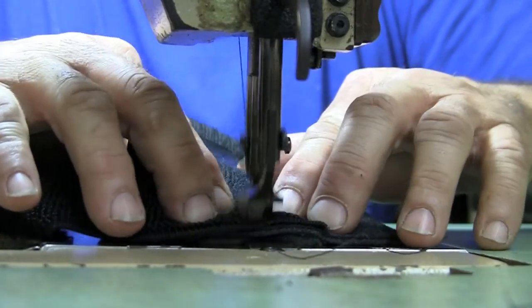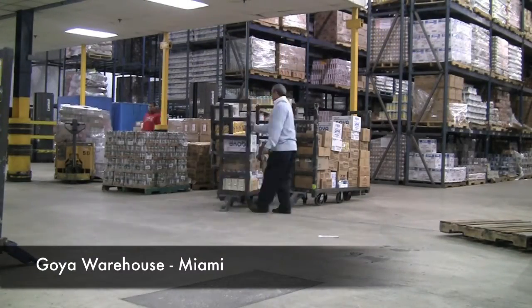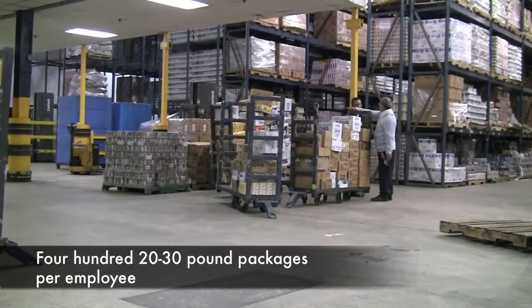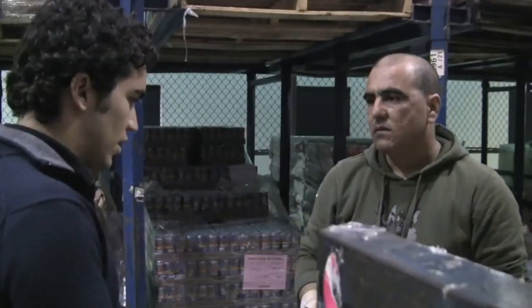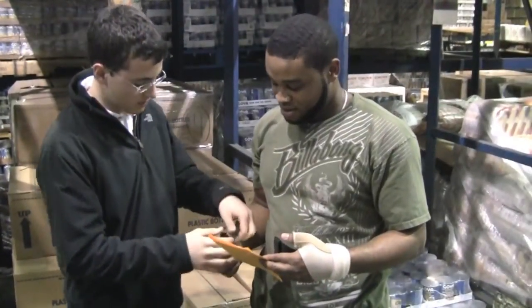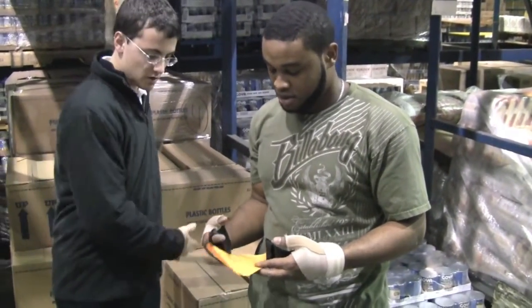The team wanted to conduct more testing, and we were able to contact Goya Warehouse in Miami. According to their warehouse manager, each employee lifts around 400 20 to 30 pound packages on a nightly basis, which has led some employees to develop pain in their wrists and fingers. After testing the Hold with employees, we were told that it does not interfere with the ability to hold papers, write, tape, or move trolleys.